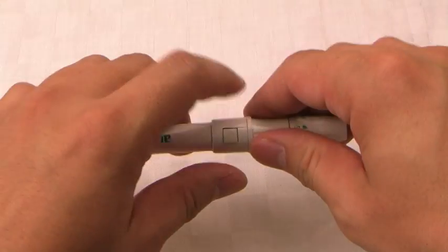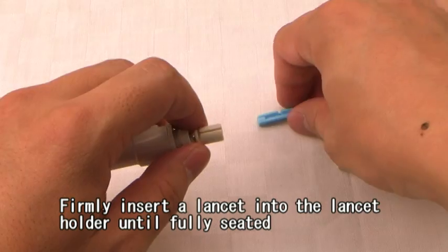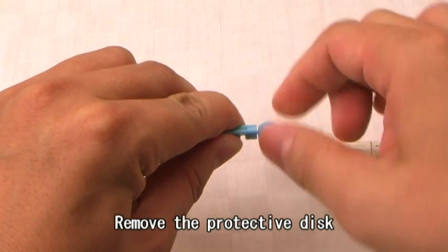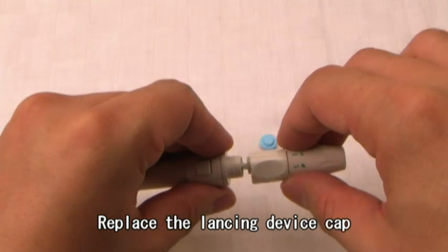Set the lancing device. Remove the cap of the lancing device. Firmly insert a lancet into the lancet holder until fully seated, then remove the protective disc. Replace the lancing device cap.